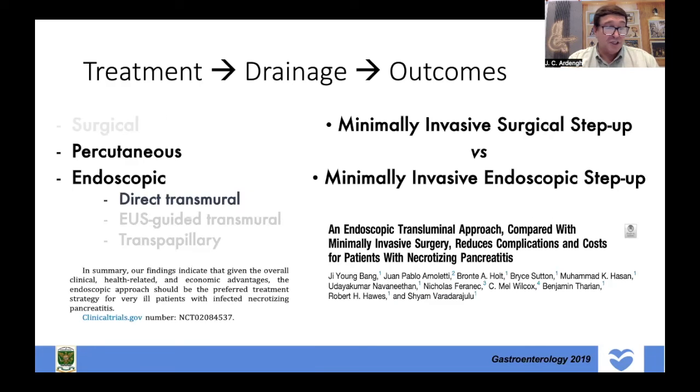This slide shows that endoscopic treatment can be proposed for pancreatic fluid collections, and nothing is more obvious than comparing the minimally invasive surgical step-up approach versus the minimally invasive endoscopic step-up approach. This study highlighted that endoscopic treatment is preferable.